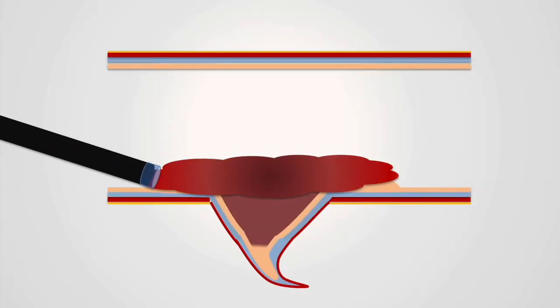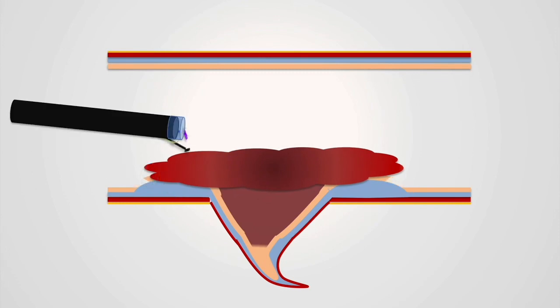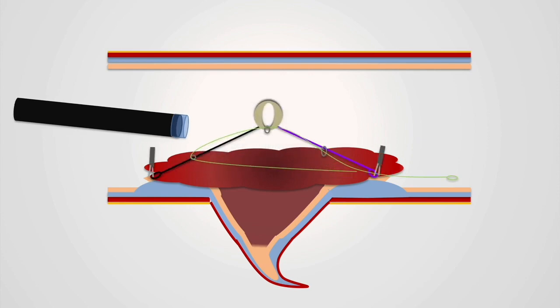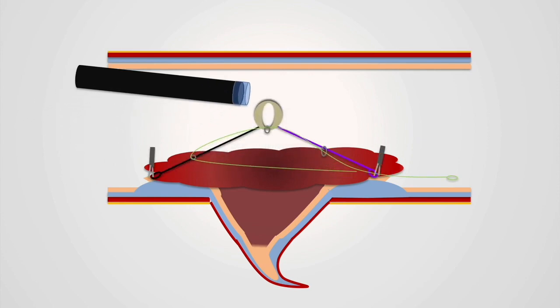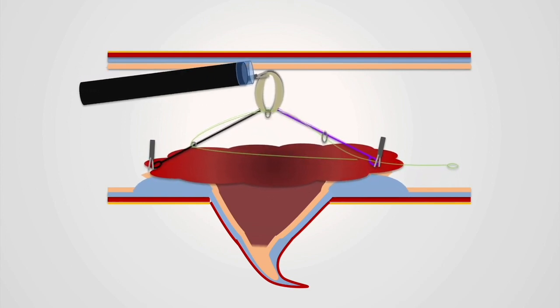And our strategy is the following: we will inject, do an incision all around the lesion, and try to dissect all around, meaning we will try to turn around the appendix. But for this, traction is absolutely mandatory.